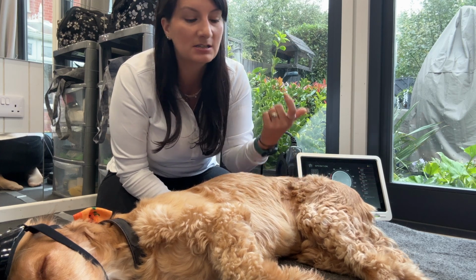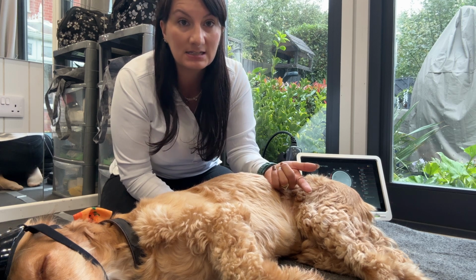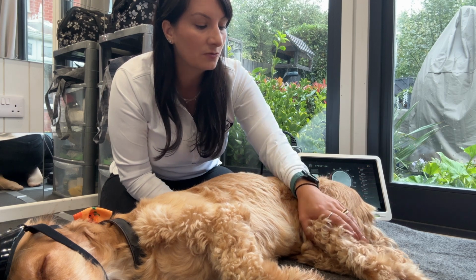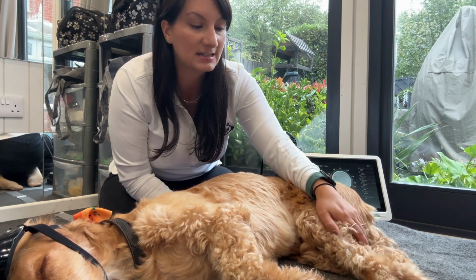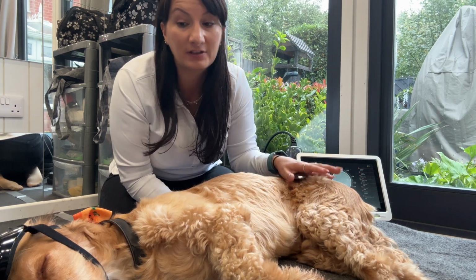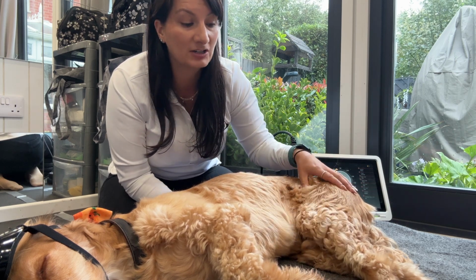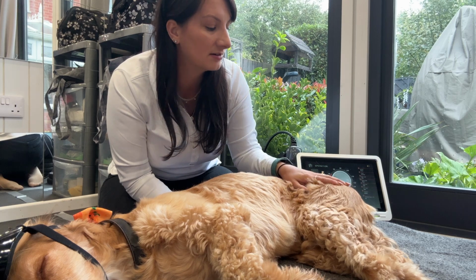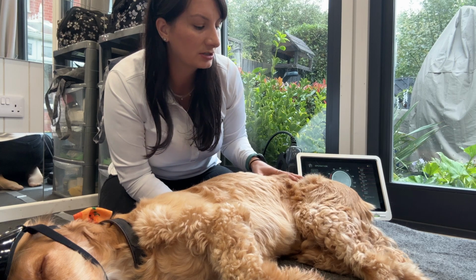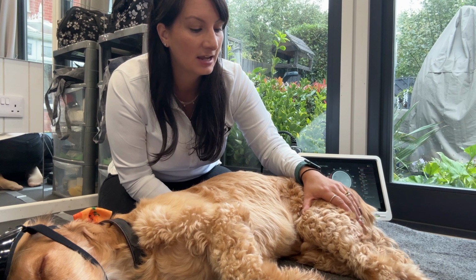What's your goal of the treatment? Anatomically, where is the location of the disease, but also what other tissues are impacted by that disease? When we're using our lasers, what are the settings? Are we going to use presets or calculate our own? If we're going to calculate our own, are we taking everything into account and not just the fact that we have a dose rate, but have you considered all those patient characteristics as well? And then actually treating the patient, again, how are you going to cover all of the tissue that you need to? How far do you need to treat?